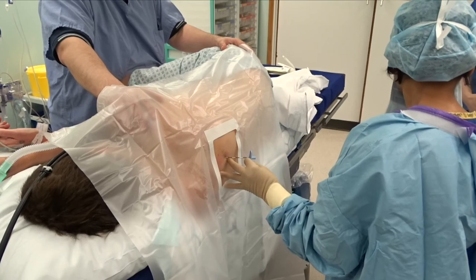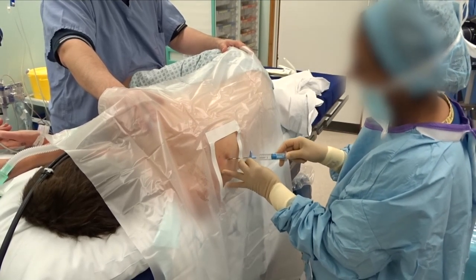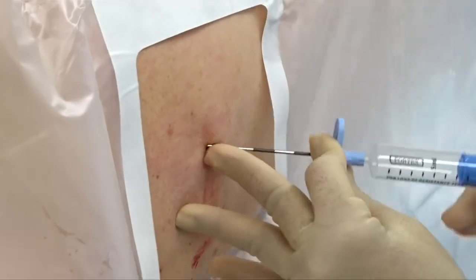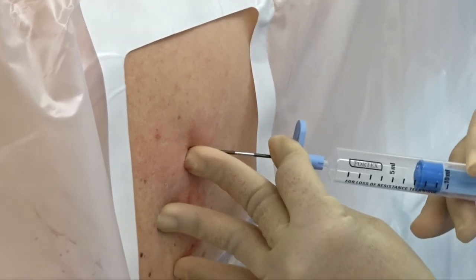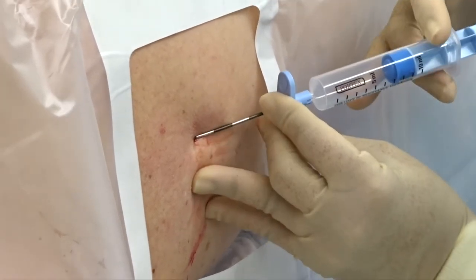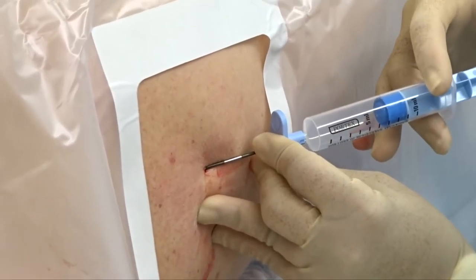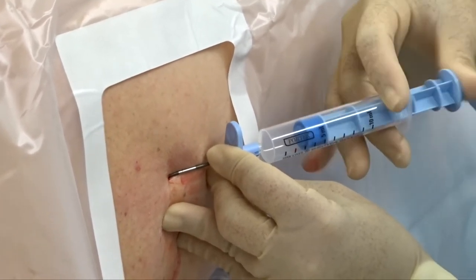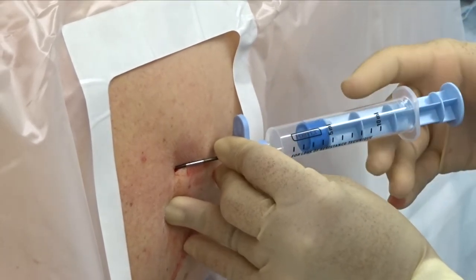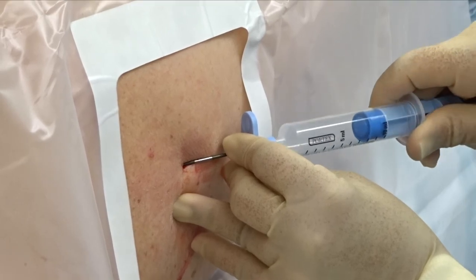Having introduced the needle a few centimetres, we attach the syringe filled with air and continue inserting the needle along the same trajectory. As the needle hits the tough ligamentum flavum, it will experience more resistance. However, as the needle reaches the epidural space, this resistance is lost. We then press the plunger of the air-filled syringe to test for the loss of resistance, which will indicate that we've successfully reached the epidural space and thus can start inserting the catheter.